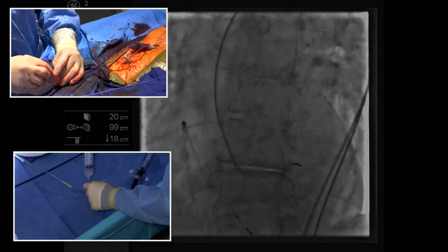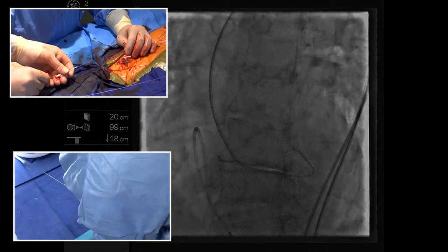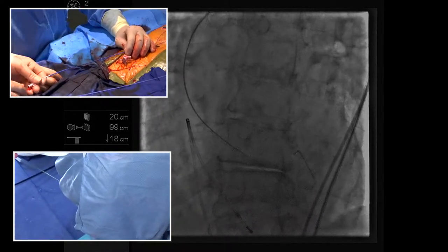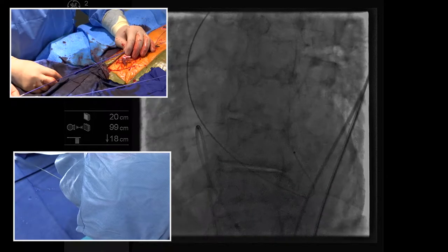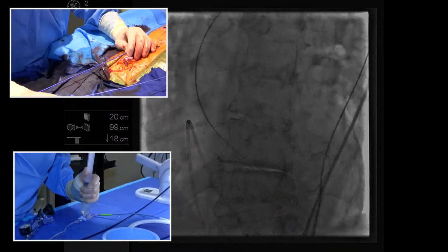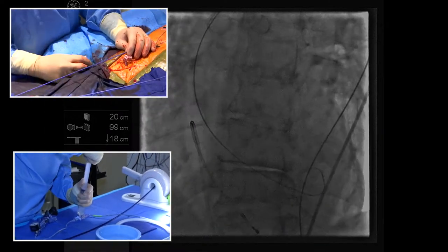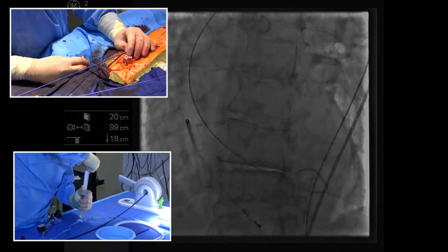Okay, so now we're in there, and Dr. Foley's going to take it out carefully. Don't lose that wire. If you lose the wire, you lose your job. Yeah, I lose the fellowship. No pressure. All right, so the next thing we'll do is get a pigtail in there, get some pressures, and then we'll put a small Safari wire.